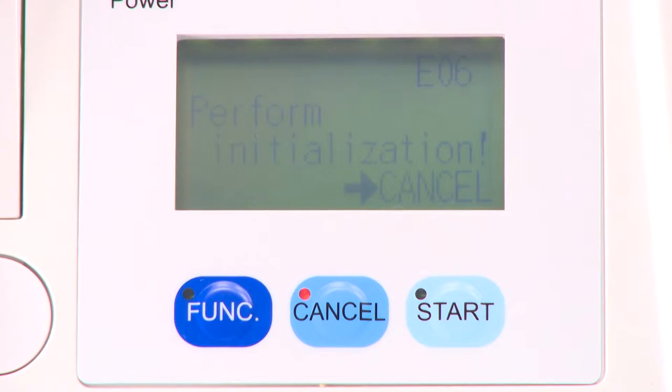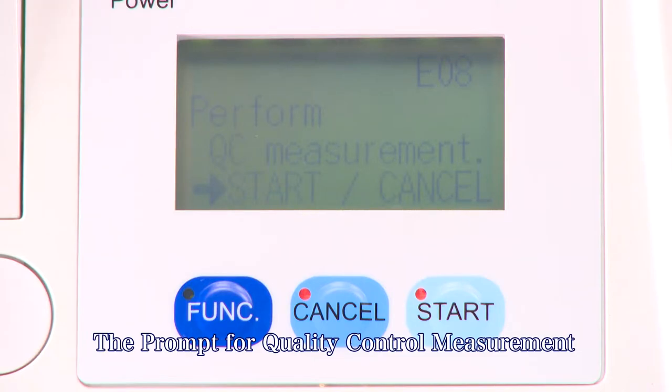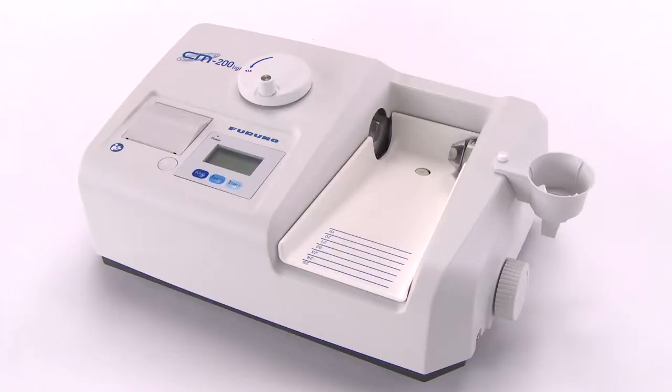Once the initialization is completed, the prompt for quality control measurement is displayed on the screen. Next, we will explain the quality control measurement.